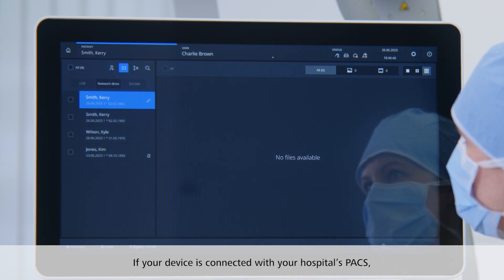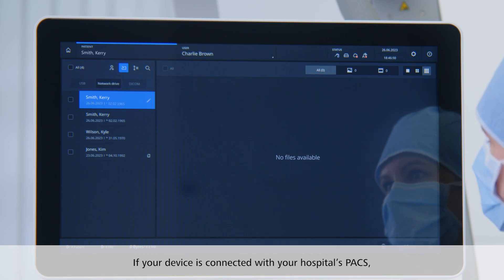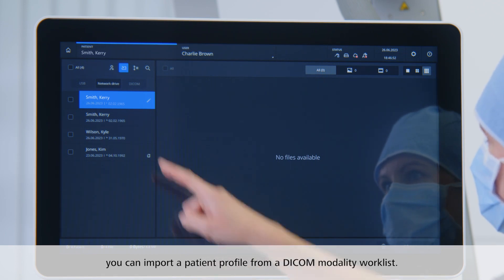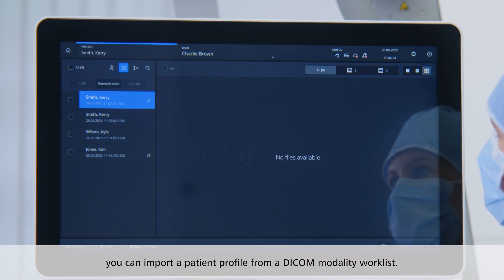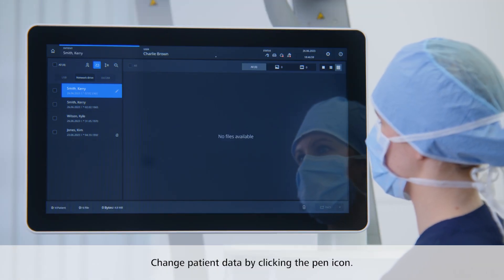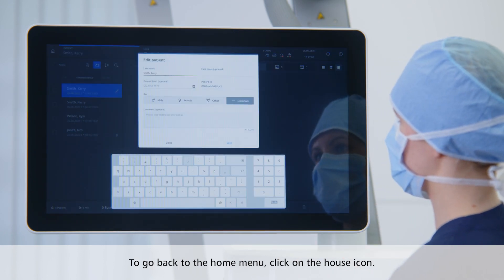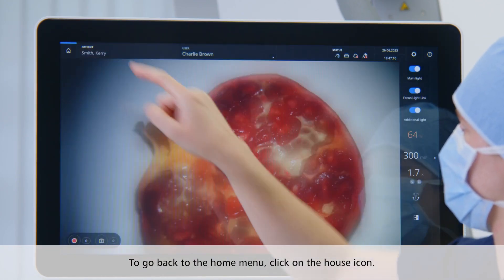If your Pentero 800S is connected with your hospital's patient management system, you can import a patient profile from a DICOM modality worklist. You can also change patient data on the device by clicking the pen icon. To go back to the home menu, click on the house icon at the left corner.